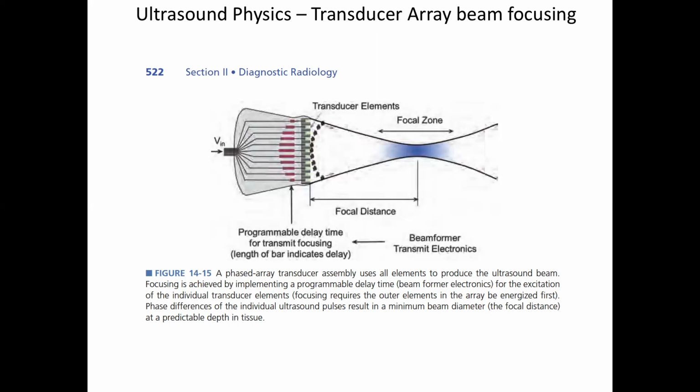And you can do the same thing in the orthogonal direction. So if we had a stack of these such that we had a 2D transducer, we can change the phase as a function of depth in this picture and focus in the slice direction, which is what you're asking for. Normally, that transducer is used to make a 3D picture by rastering in 3D around in the object.